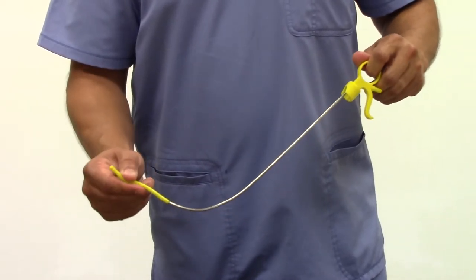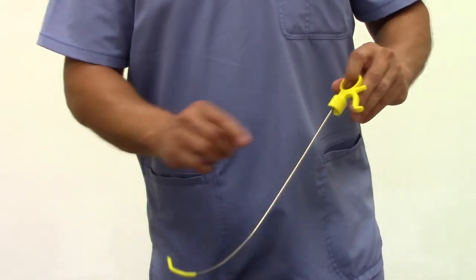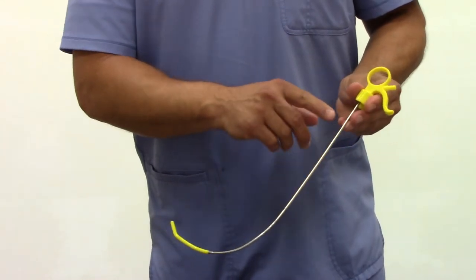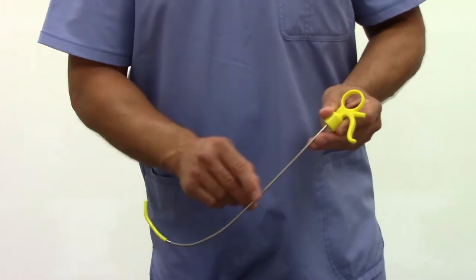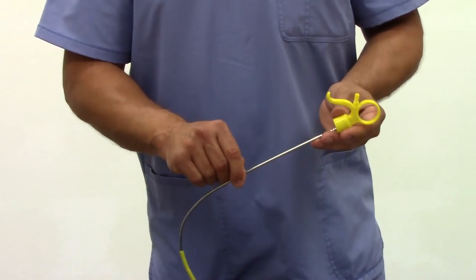The flexible introducer tip facilitates placement into the trachea during intubation. An ergonomically designed handle with thumb release allows easy insertion and removal from the endotracheal tube. And a supplemental oxygenation port allows practitioners to perform apneic oxygenation techniques during the intubating process.